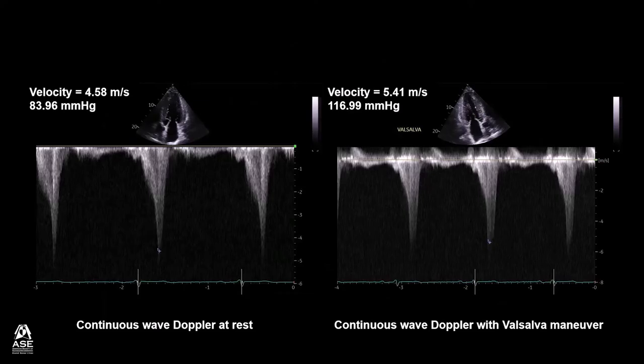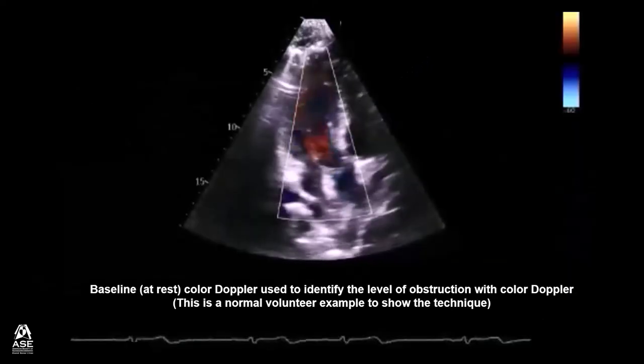This is an example showing the continuous wave Doppler at rest in a patient with hypertrophic cardiomyopathy. Note the velocity at rest is 4.58 meters per second. The velocity with the Valsalva Maneuver is 5.41 meters per second.